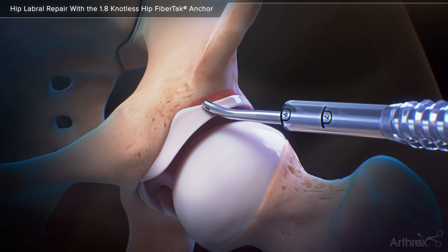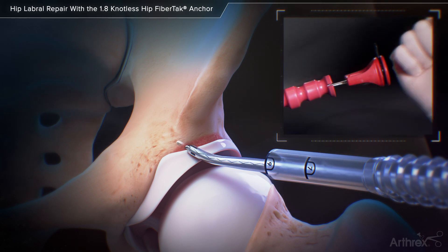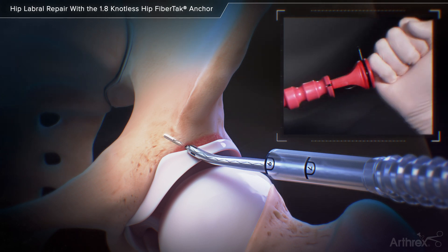Place a 20 degree curved drill guide on the acetabular rim and use a flexible drill pin to create a pilot hole for the anchor insertion. Insert a knotless hip fiber tack anchor through the drill guide and impact the handle by hand to a positive stop.